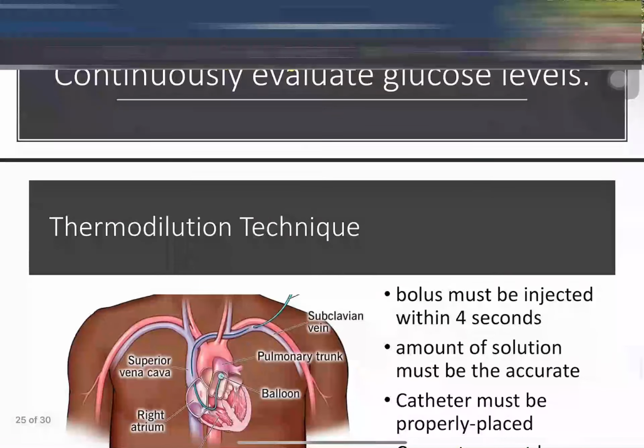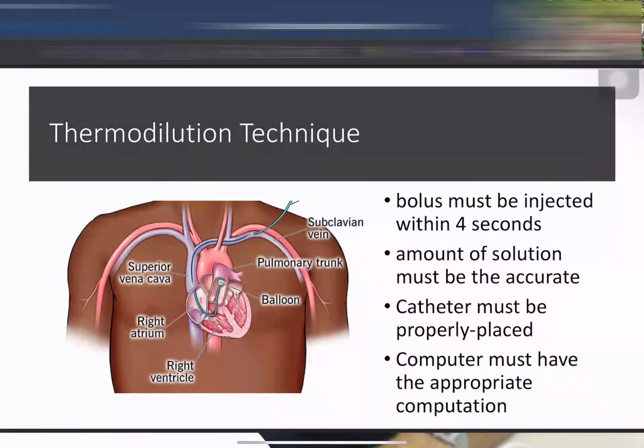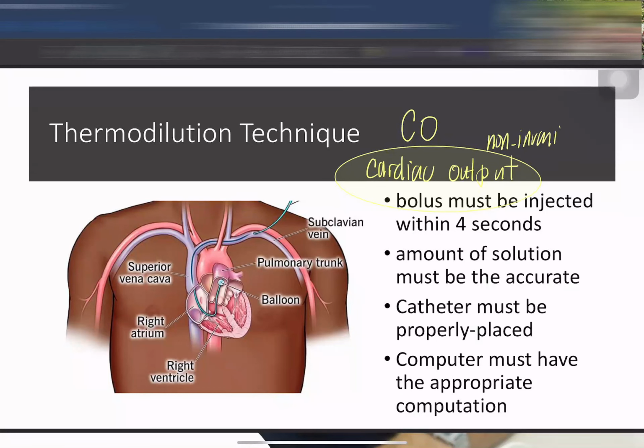Next, we have the term thermodilution technique. No? But thermodilution technique is more on the physician side already. From our end as nurses, please understand that your thermodilution technique is a technique that allows us to measure the cardiac output. Again, class, your thermodilution technique allows us to measure your cardiac output non-invasively. It allows class for the non-invasive monitoring of your cardiac output. Ang naging invasive lang na part nito class is the injection. Other than that, wala na po.